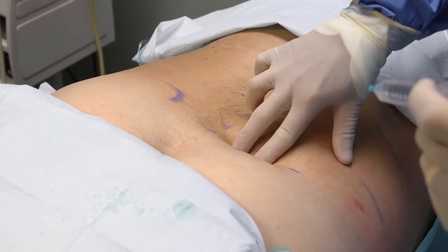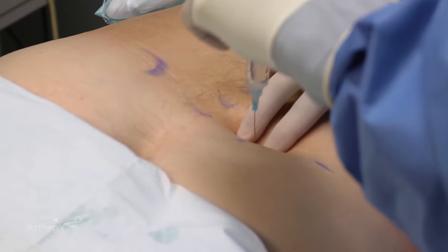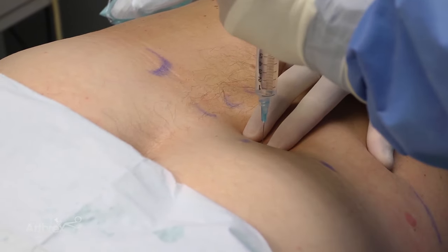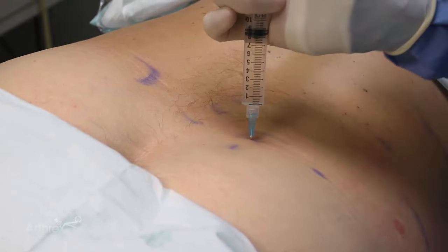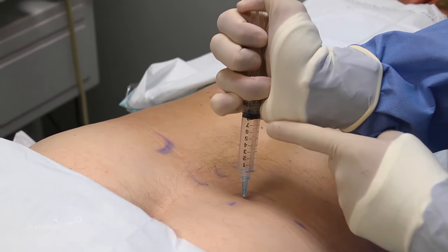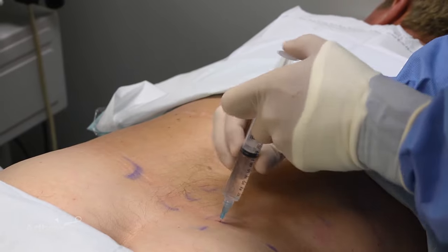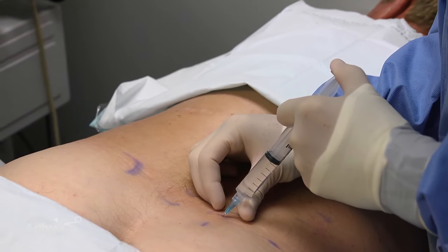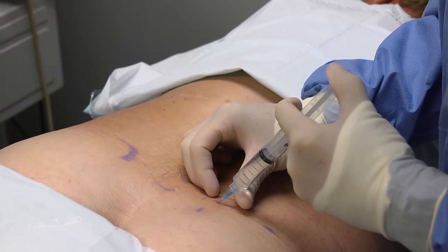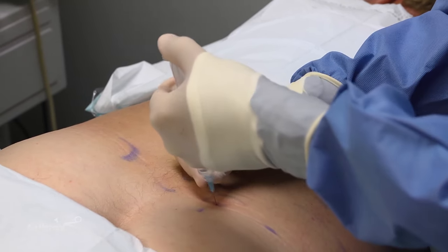I'm going to put my fingers right on the sides of the PSIS so I can feel the inside and outside edge. I'm going to feel that bony cortex and go straight into the cortex, pushing pretty hard to lift that periosteum up off the bone edge a little bit — I can only get in maybe two-tenths or half a cc here. So there's a cc in the periosteum, and then I'm going to cone around the soft tissue. I treat the periosteum and the bony PSIS first, and then cone around.